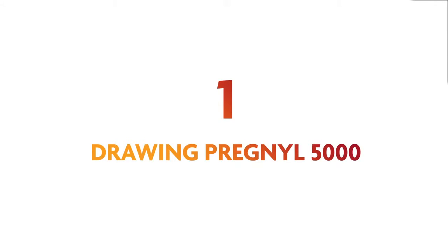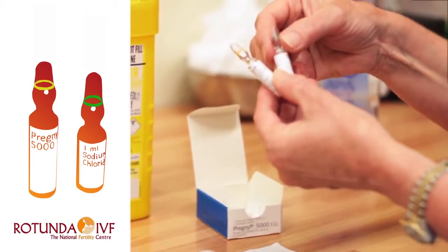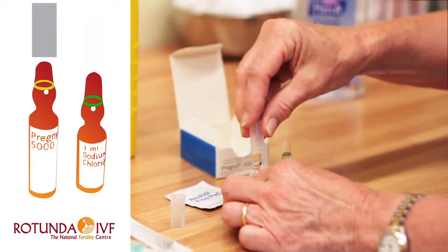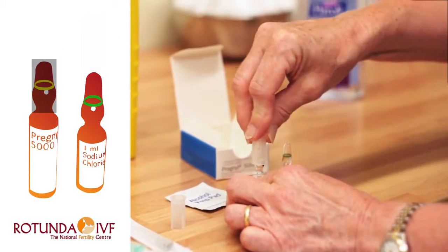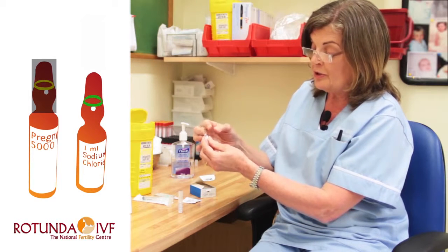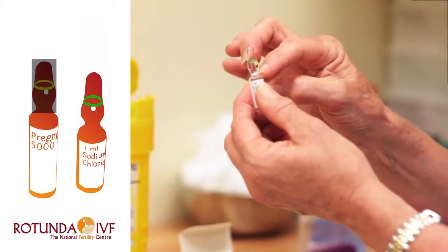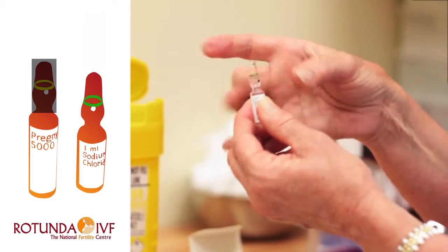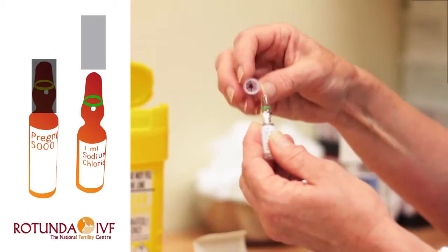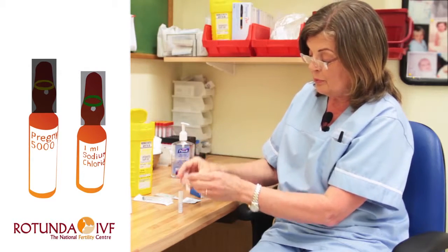There are 2 ampoules in the box, a powder and a water. Take your first one, the powder, and place the ampoule cover over the neck of it. Take your vial of liquid, just make sure that there's no fluid above the neckline. If there is, you can just simply flick it down with your nail. Then take the other ampoule cover and place it over the top of the ampoule.